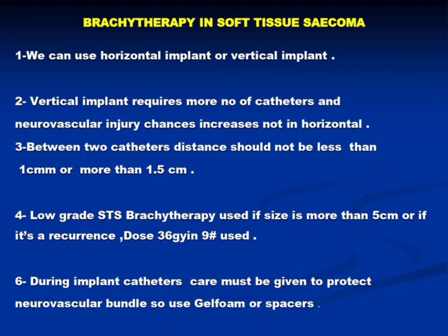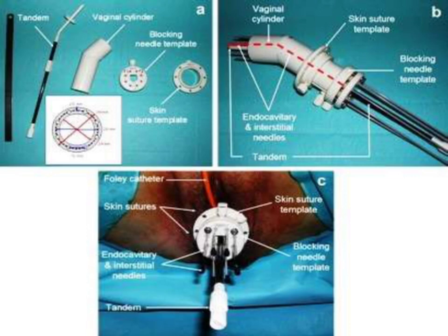That figure shows an interstitial implant. It's important to first clearly define the target volume for interstitial implant, and to have a pre-planned number and distribution of radioactive sources and applicators to be used. And a homogeneous dose distribution is very important, because high dose around each source can cause necrosis, and low dose between two sources can result in recurrence of a tumor. So the dose should be homogeneous.